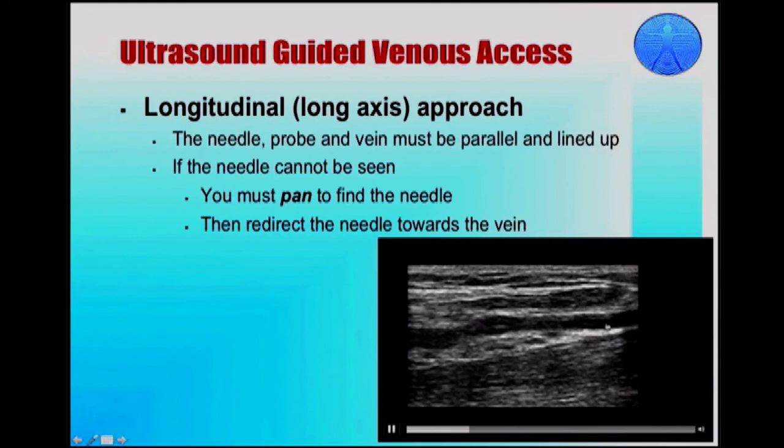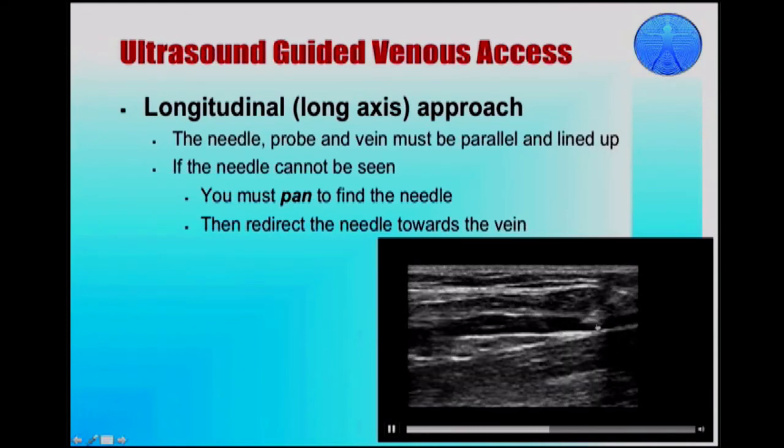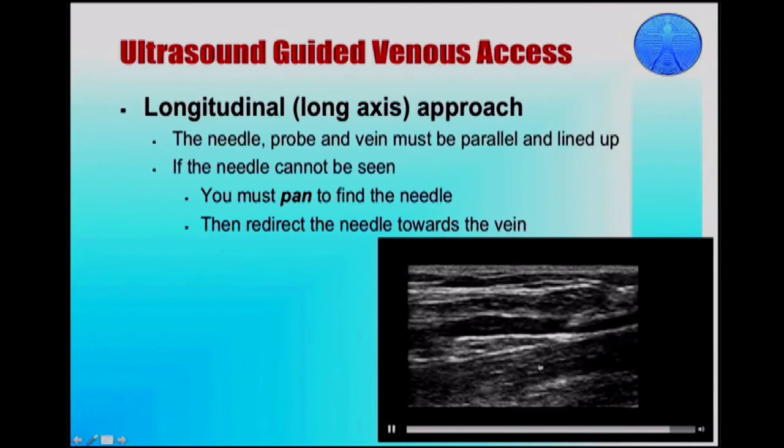Here's our vessel. You can tell that the walls are bright. They're not so bright down here. We're not lined up here. We're lined up here. And when the needle came in, we're going to watch this repeat again. When the needle came in, it was not very bright. It was dull. It was not in the same plane.